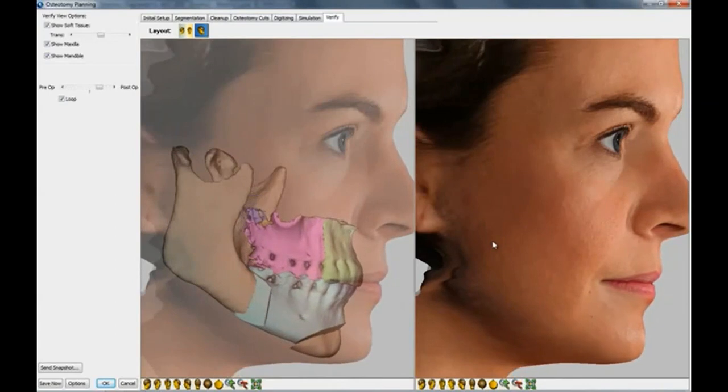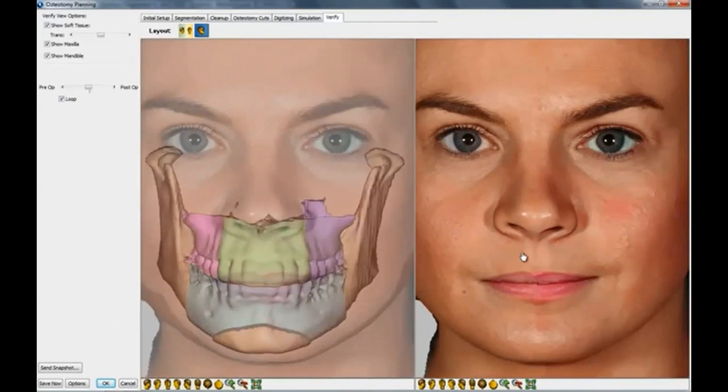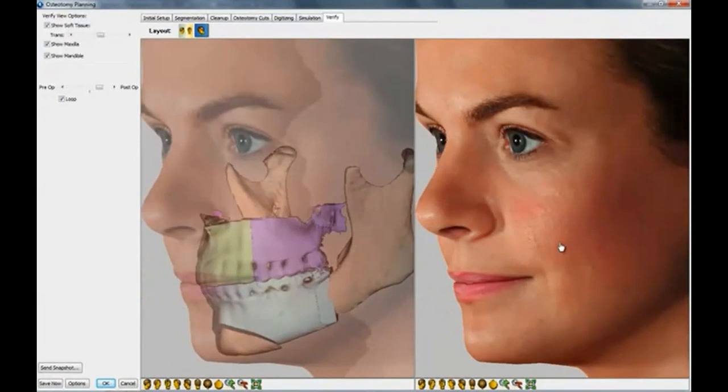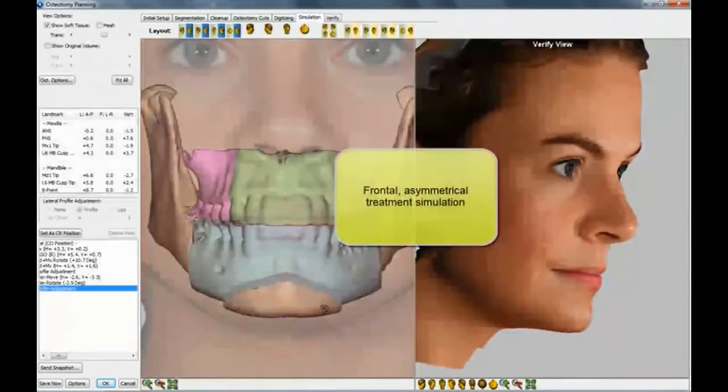So that's mostly we are using a clinical video, but in advanced clinics, you can actually go ahead with this 3D video, which will also help you motivate the patient. You can show the patient that after you wear this appliance, you will look like this, so your profile will improve. So you'll be able to get patient cooperation by motivating the patient in a better way.